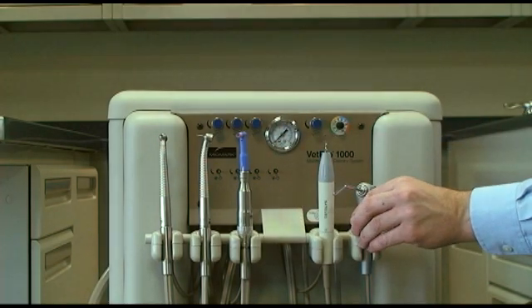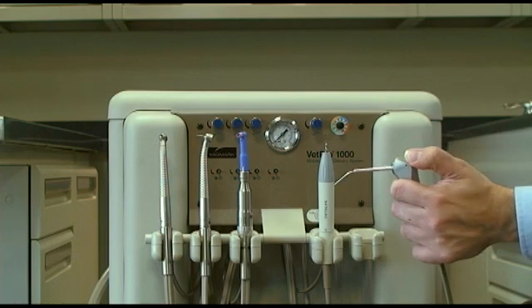You also have an air and water syringe. Only one handpiece can be used at a time.